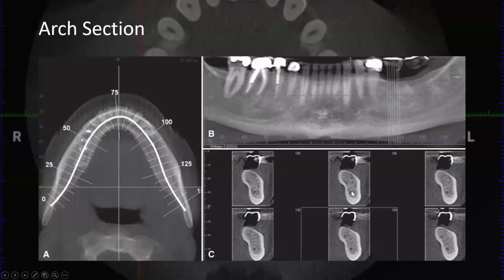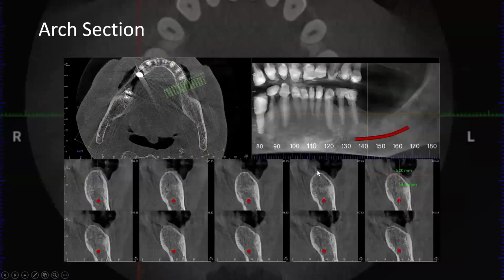The inferior alveolar canal is way down there. That's probably almost 30 millimeters to the top of the alveolar bone. And then again, we have the nerve traced. We have this directed in the same direction the implant's going, multiple cross-sectional views.